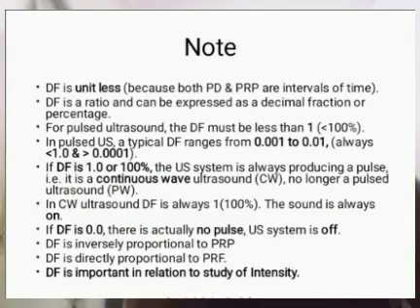So I need you to take note of this. Duty factor has no unit, and duty factor is a ratio and can only be expressed as a decimal fraction or percentage.